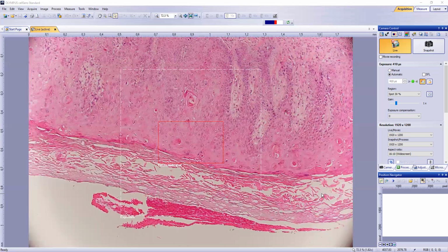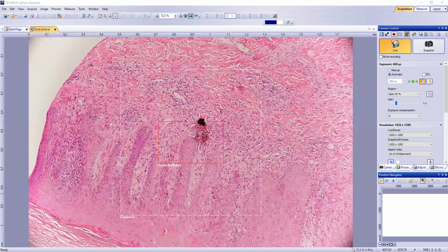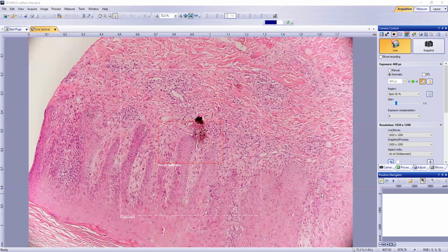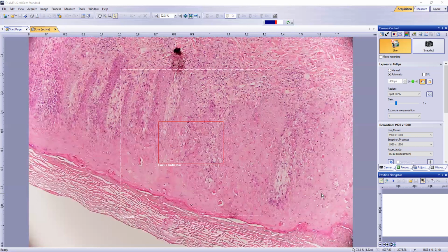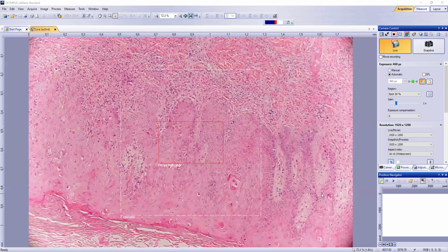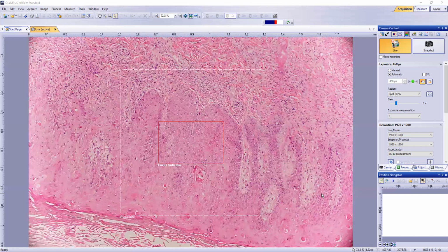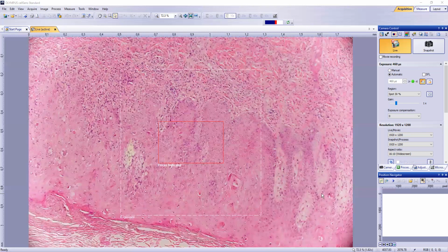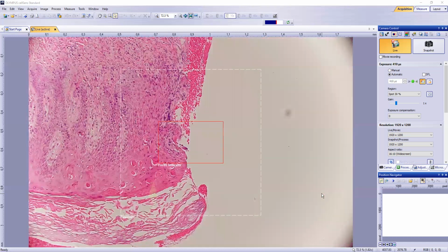The epidermis is typically not hyperplastic. It might look hyperplastic in this example because we're biopsying a site where the epidermis is usually thicker. So you have to know where the biopsy was obtained from in order to assess whether or not the epidermis is hyperplastic. This is an acral site. Another feature of erythema multiforme is you'll have many necrotic keratinocytes, and you'll see them at all levels of the epidermis. In some areas, those necrotic keratinocytes start to become more confluent, so you might have zones of epidermal necrosis.